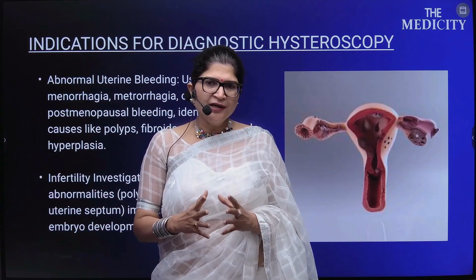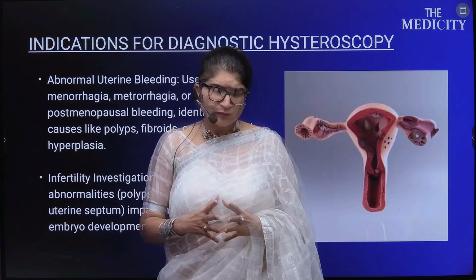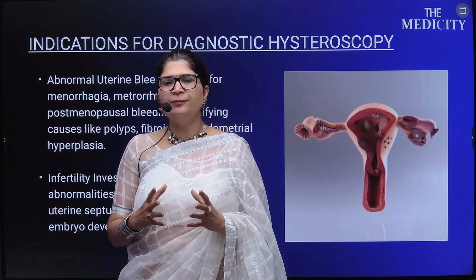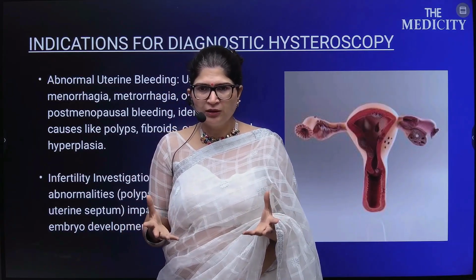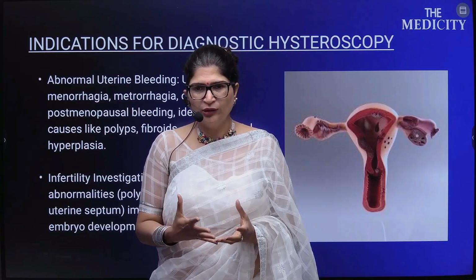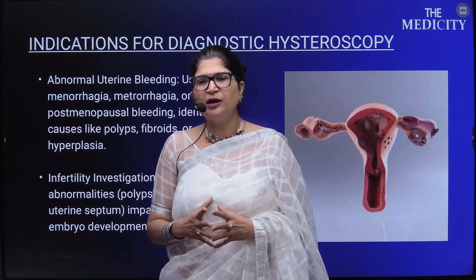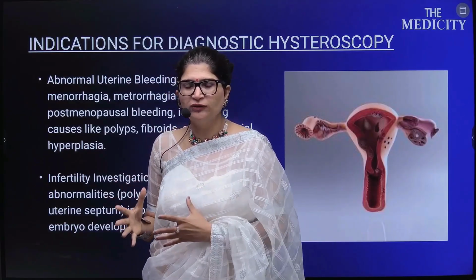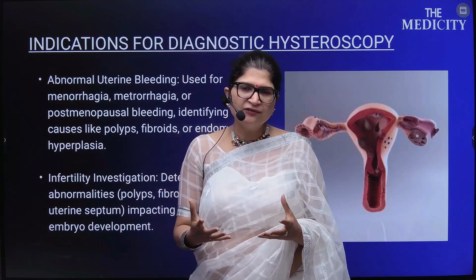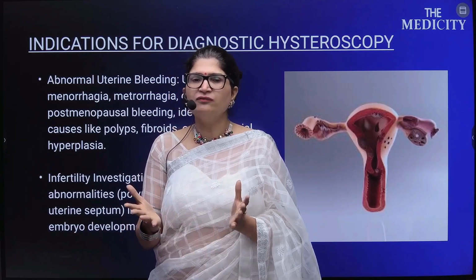Now, the second indication for diagnostic hysteroscopy is infertility workup. In cases of an infertile couple, there are many causes which are not even identified on a simple ultrasound. So hysteroscopy comes as a modality where we can identify polyps, adhesions, uterine septa, or fibroids which can lead to infertility. And once they are treated or operated on by hysteroscopy, the patient conceives very well after the treatment.